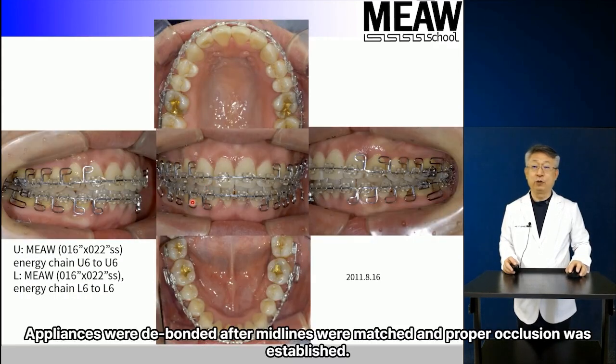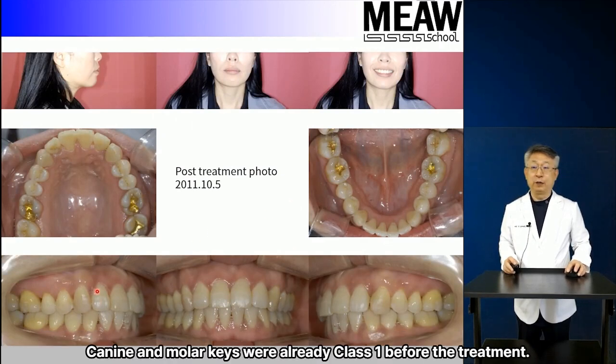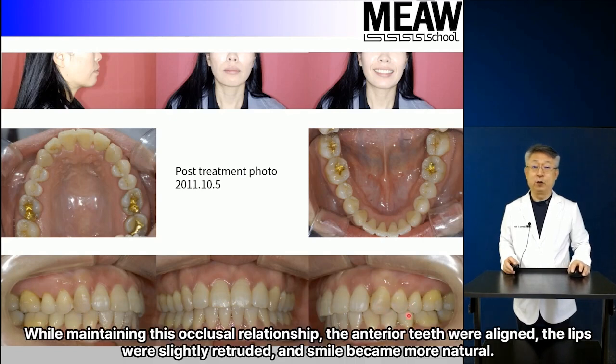Appliances were debonded after midlines were matched and proper occlusion was established. Canine and molar keys were already class 1 before the treatment. While maintaining this occlusal relationship, the anterior teeth were aligned, the lips were slightly retruded, and smile became more natural.